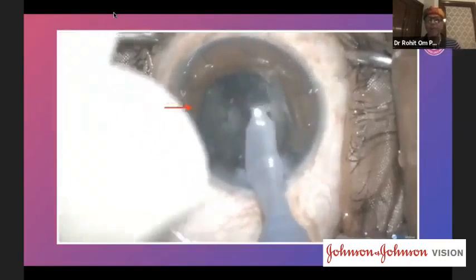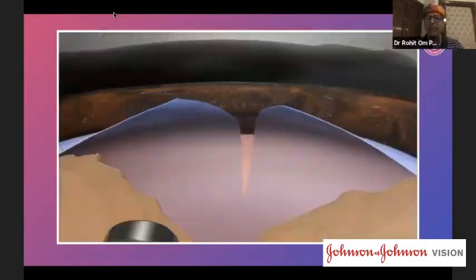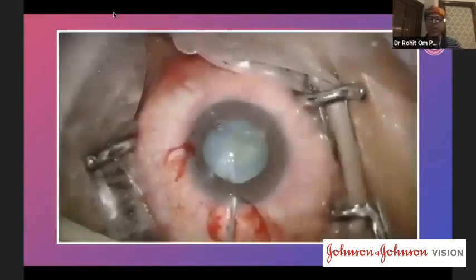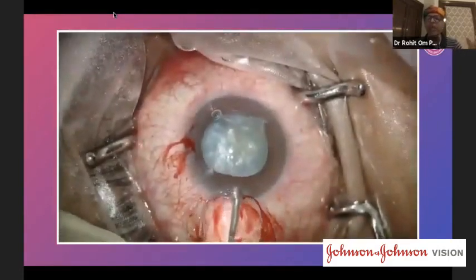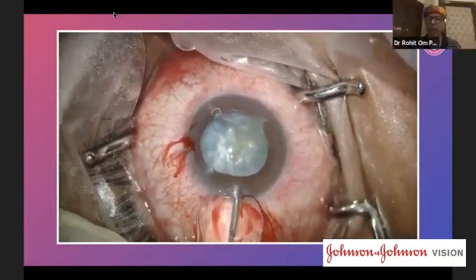Flap stops fluttering, it is the end point of safe emulsification. It appears much before the classical signs of posterior capsule rupture. When does FMS manifest? When you inject the visco, you will see how it has gone in averted.